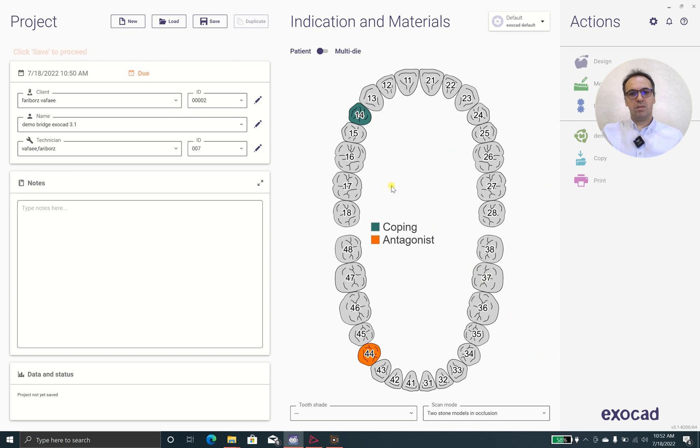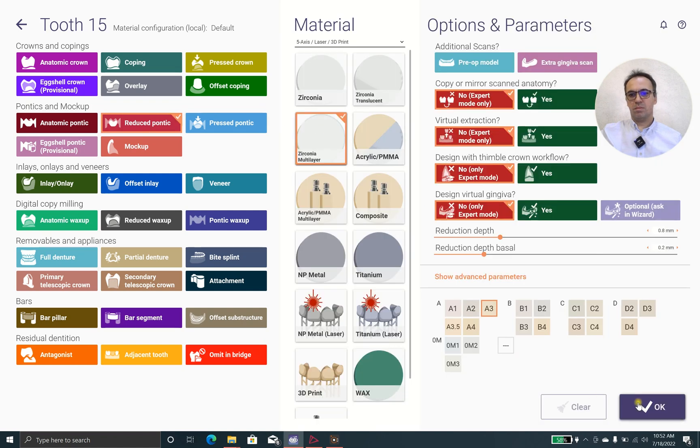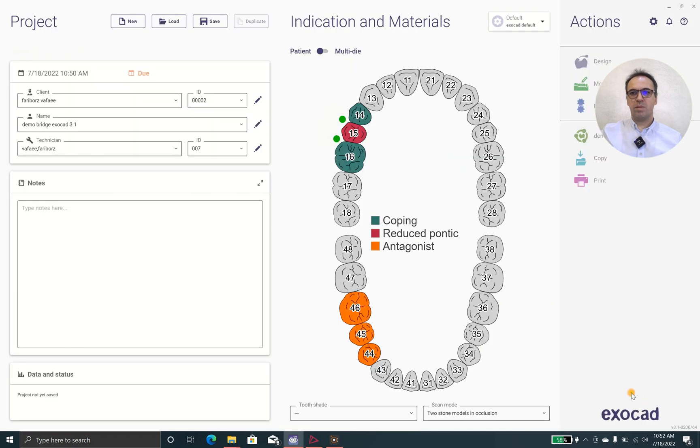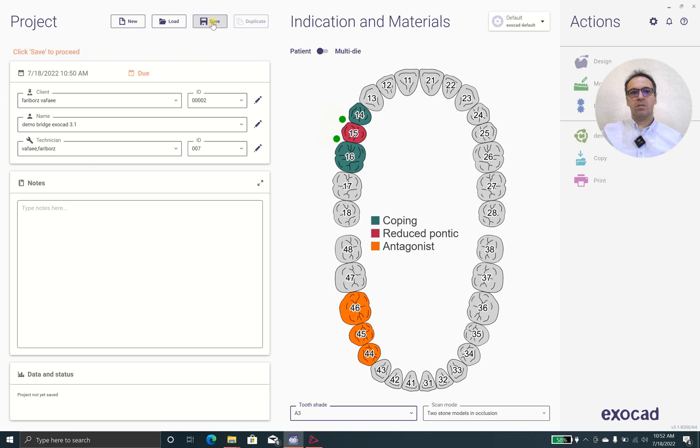I use Ctrl and select Coping and Reduce Pontic. The software chooses automatically based on the last selection. The same shade A3, Zirconia Multi-Layer. I'm happy with it. Color A3 and I will save it. Let's check this.